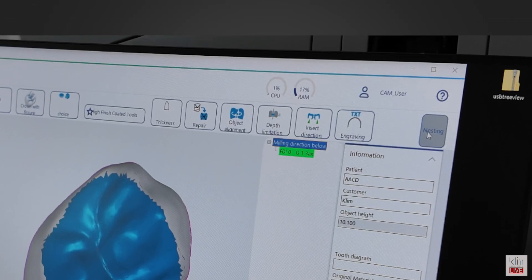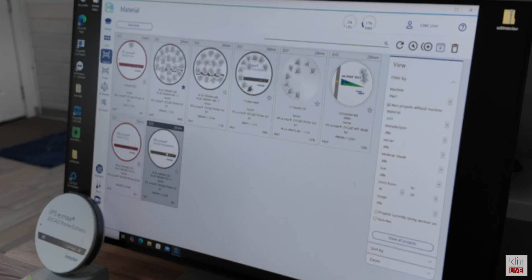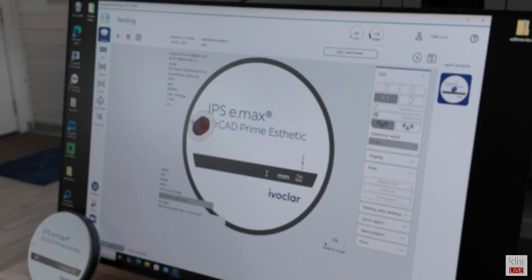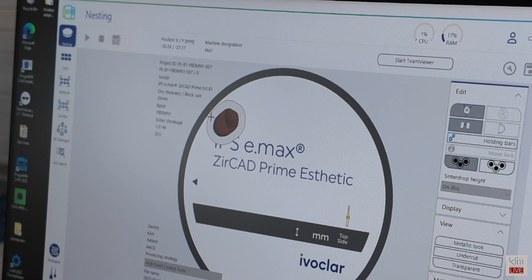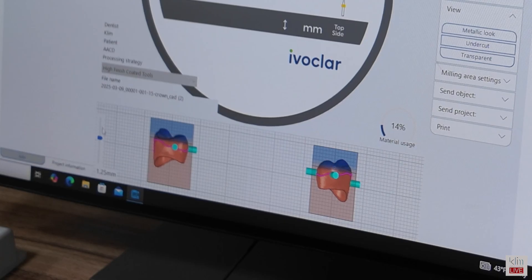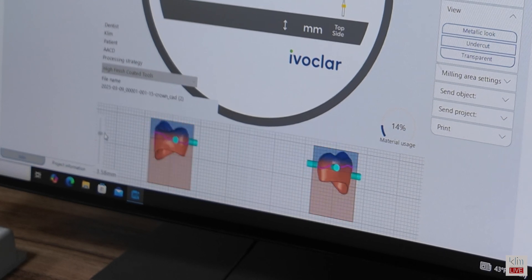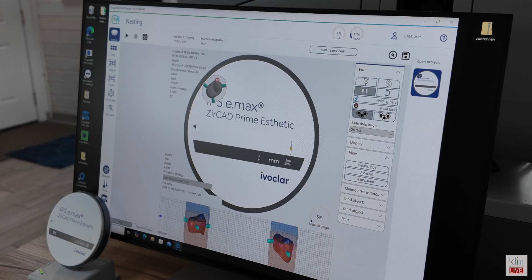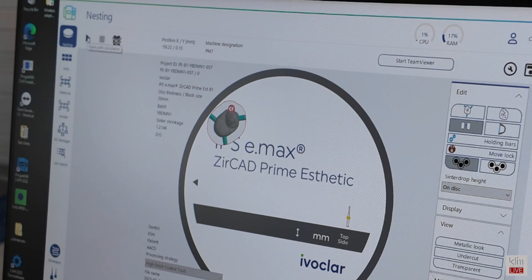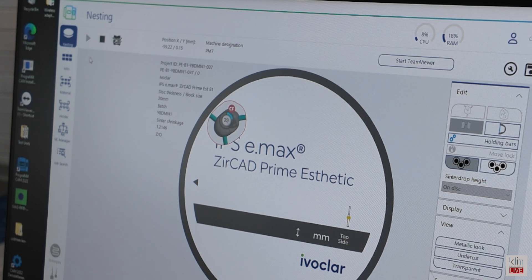To send off to your disk, click on nesting. You will see the portfolio disks that are available — click on the disk that you want. It automatically will populate that disk. Then we place the holding bars by clicking on zones that won't be in contact. When you're done with the holding bar placement, click on the disk and it will activate to the next step. With a multi-layered disk like this, we can move it more aesthetically — we want to move it to the top of the block, which will provide more translucency. Once completed, click on open path calculation and that will render the restoration ready for milling.